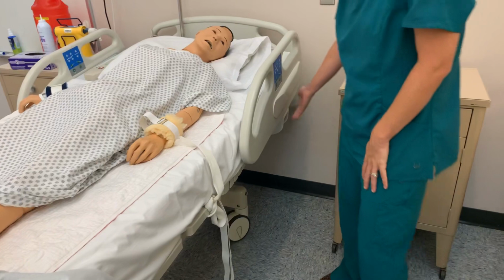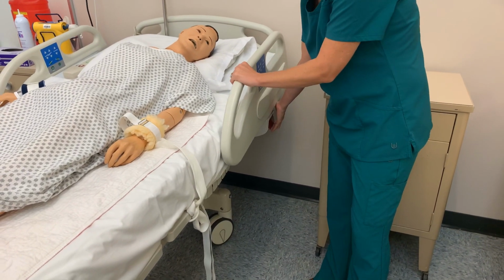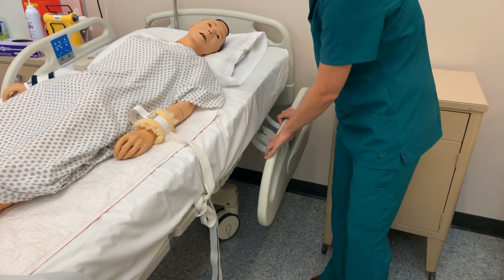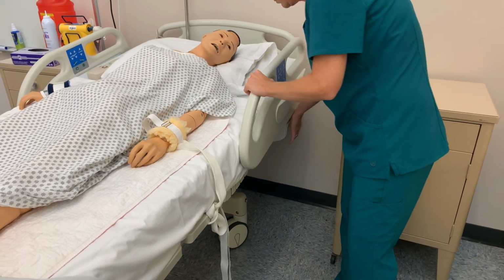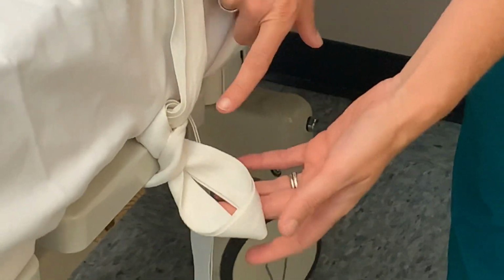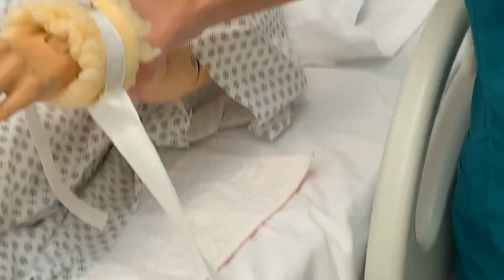Because see, a side rail would not be where you would want to tie one. Because what does this side rail do? It moves, so that would change the position of the restraint, okay? Put that back. You also notice this right here is called a slip knot, okay? This is used for an emergency procedure where, oh my goodness, I need to release my client. I pull it, they're released, okay?